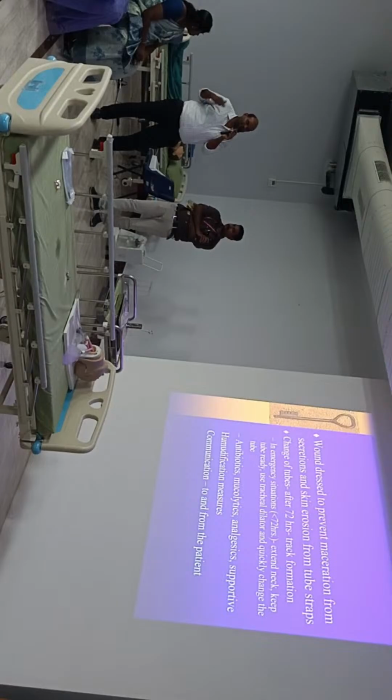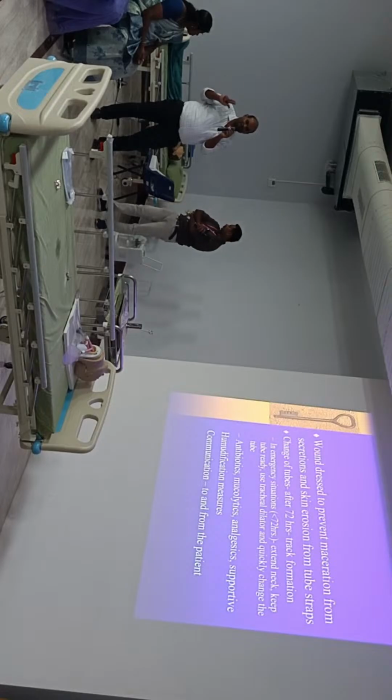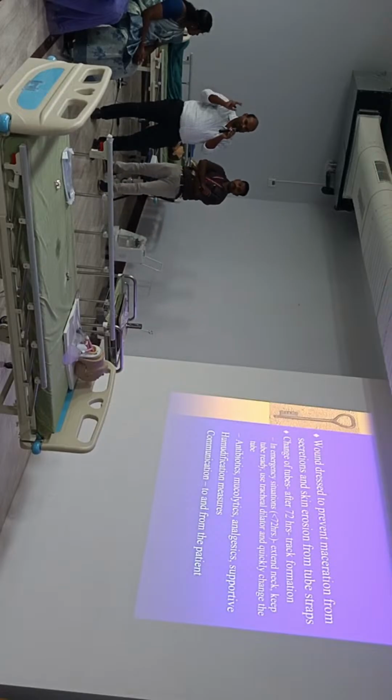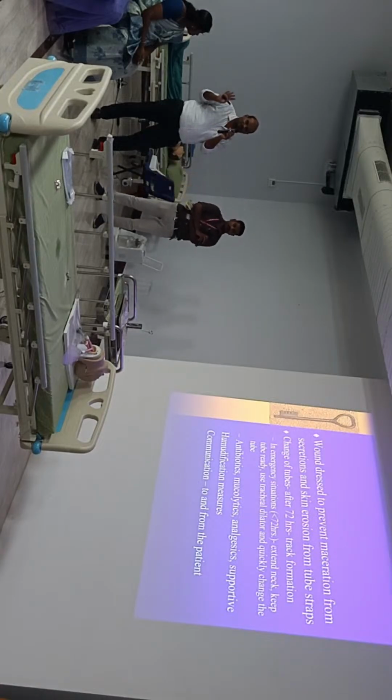In emergency situations, sterility is not a problem. You can do with whatever dirty instrument is even available in the dustbin. In an emergency, sterility is not at all a problem. We can always cover that with antibiotics. Tracheostomy tube block is always an emergency. So sterility is not of prime importance in tracheostomy emergency procedures.